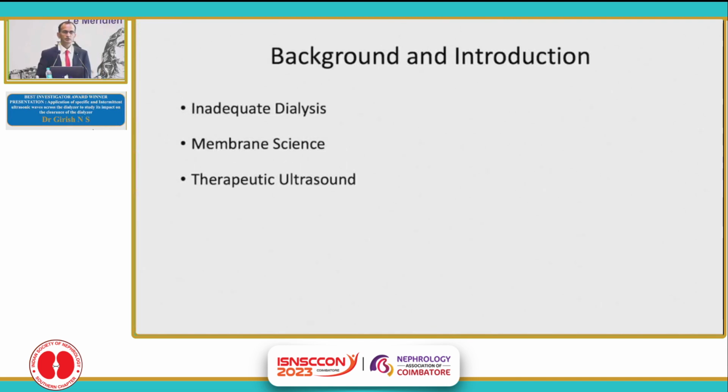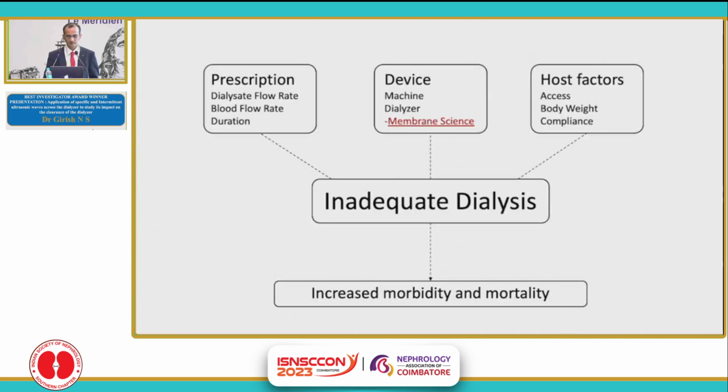So to start with the background, this project basically revolves around three aspects: dialysis adequacy, dialysis membrane science, which is a less explored topic, and the therapeutic use of ultrasound in nephrology. As the earlier speaker, Dr. Sharma, alluded to, inadequate dialysis is a major problem, and there are a number of predisposing factors to it, which I have conveniently divided into three zones.